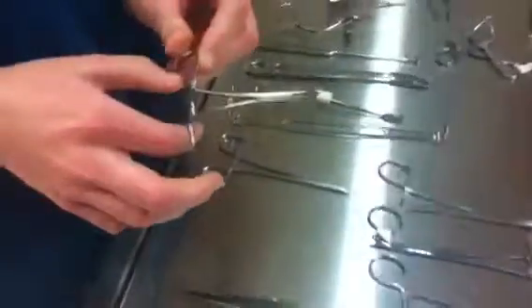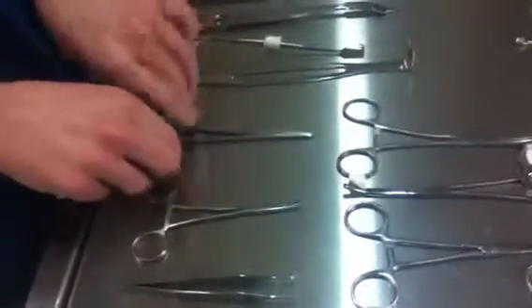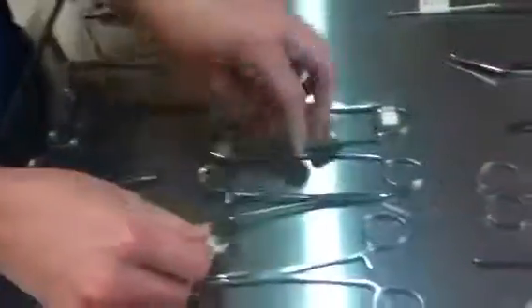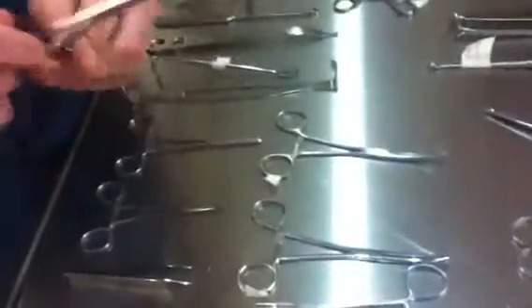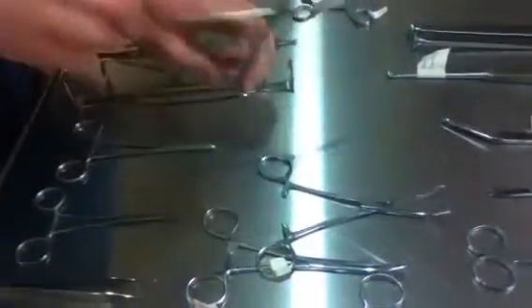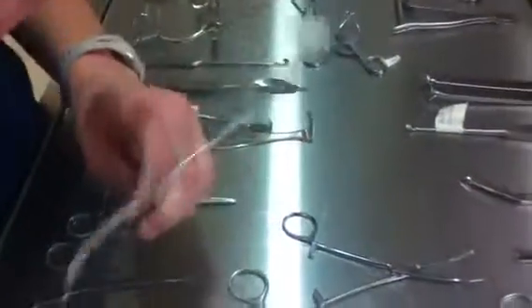This is the Halstead Mosquito hemostat. This is Kelly. I'm doing all the hemostats. This is going to be Rochester Peen. This is Rochester Ochsner. Rochester Carmalt.